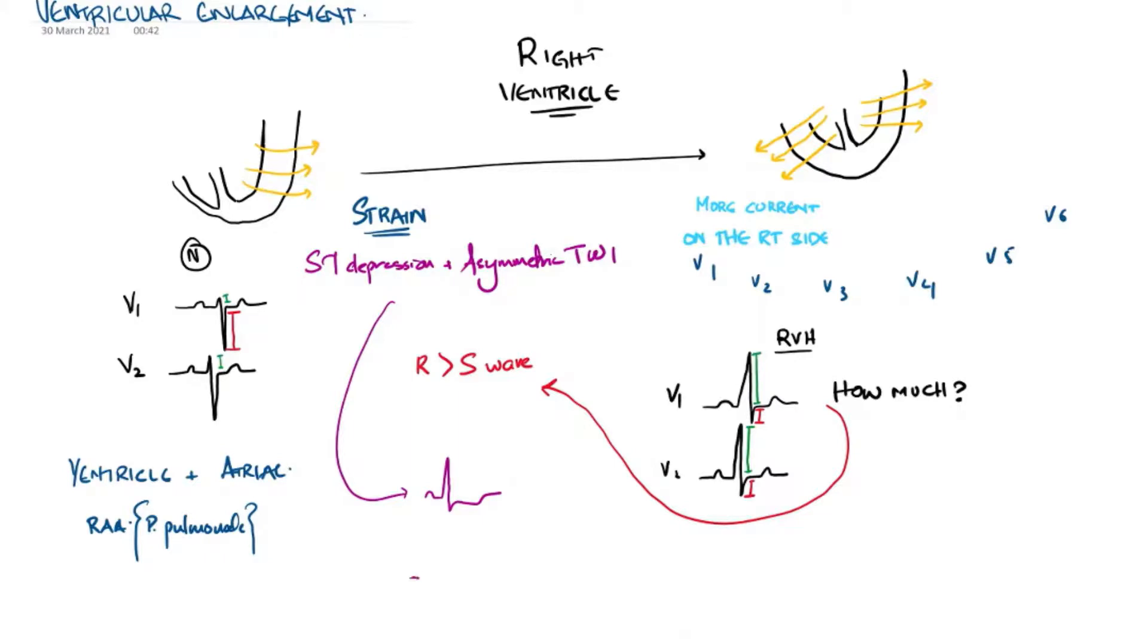Now this is strain, but there are also variants of strain. So you've got ST depression, asymmetric T wave inversion, and then again, pretty much just a flat STT segment. So these are known as either strain patterns or you can call them strain equivalent. And these basically increase the sensitivity of diagnosing RVH on an ECG.